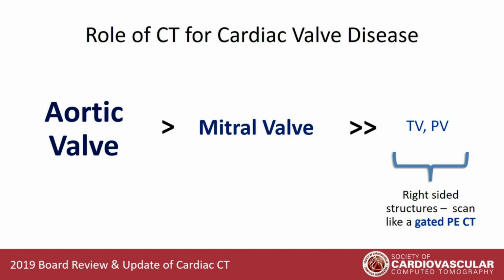So this is certainly possible to do. When you're evaluating valves on both sides of the heart, that's when we begin to think a little bit about what's going to be tricky about this examination from a technical perspective. Normally what we do at our institution is what Dr. Shapiro alluded to yesterday, and we try to build a coronary CT angiography acquisition protocol with a mixed flush, so not a pure saline flush, but maybe a 50-50 or a 70-30 blend, so we still get adequate opacification of the right-sided cardiac chambers as well as left-sided cardiac opacification. If you have more technical questions, I'm happy to answer them afterwards or in the question and answer session.